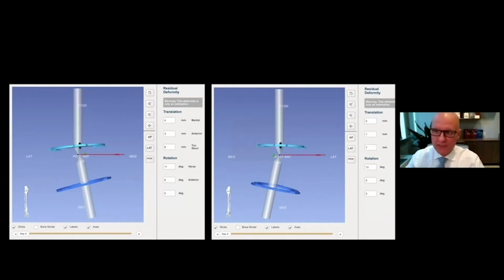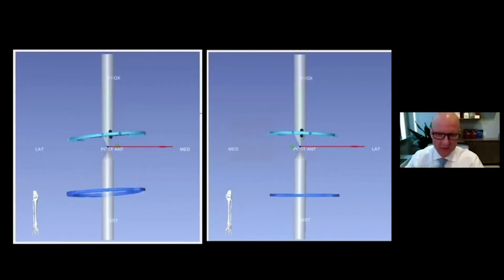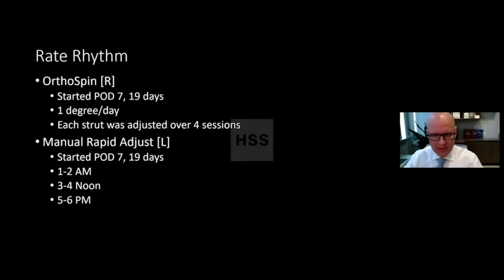And then once you have the schedule, we'll give that to our technician or the OrthoSpin group, and they'll then upload that into the system, and then they'll do the magic that divides these adjustments into multiple sessions. So in this patient, on the right side, he had OrthoSpin. We started post-op day 7. It was a 19-day schedule. We set it for a degree per day, and each strut was adjusted over 4 sessions.